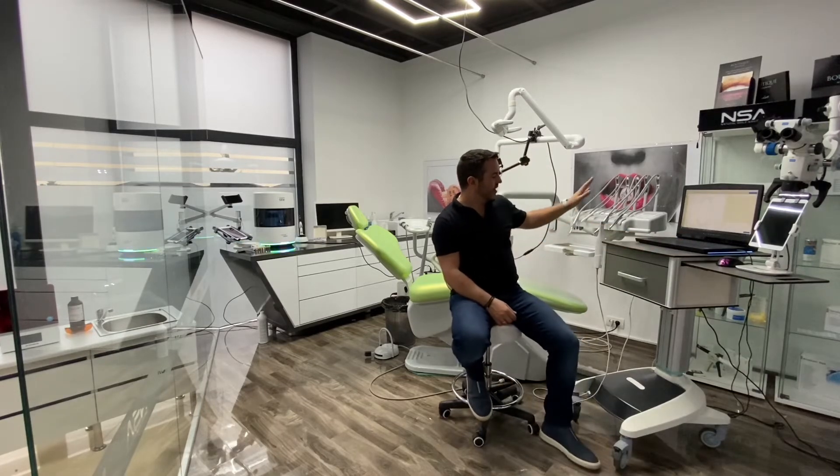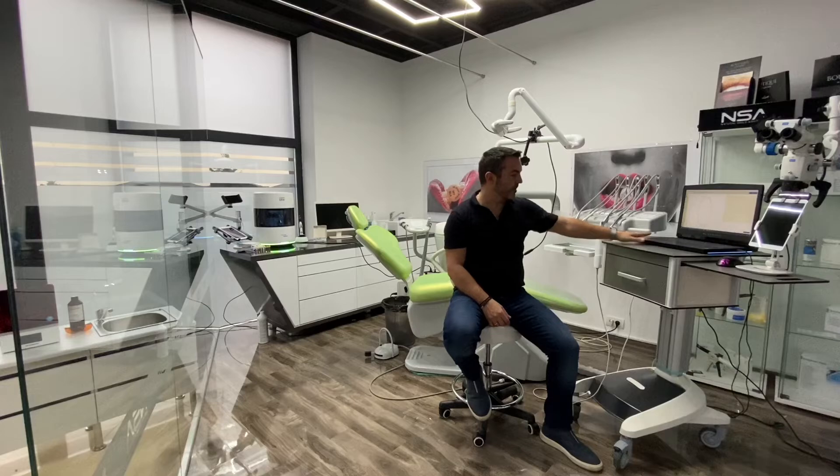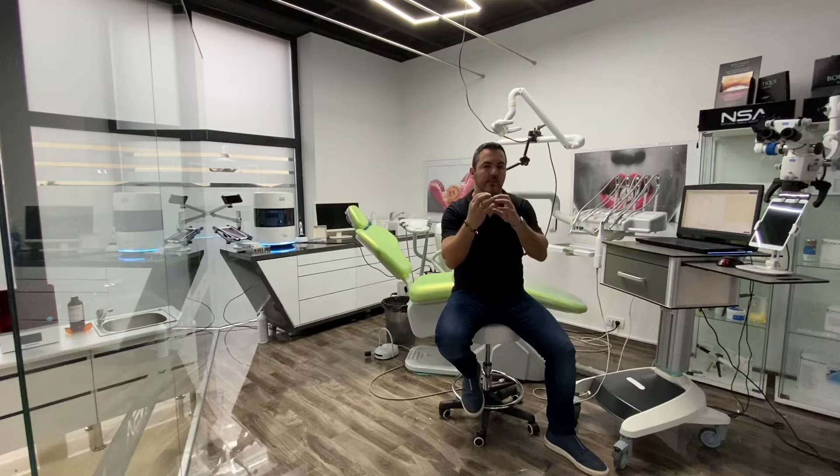As a dentist, all you have to do is scan the intraoral files and the face scan files, send them to the laboratory, and the lab will integrate them and create a virtual patient. We'll have a 3D head with a 3D impression in the computer and then we can design a predictable, facially guided future smile.